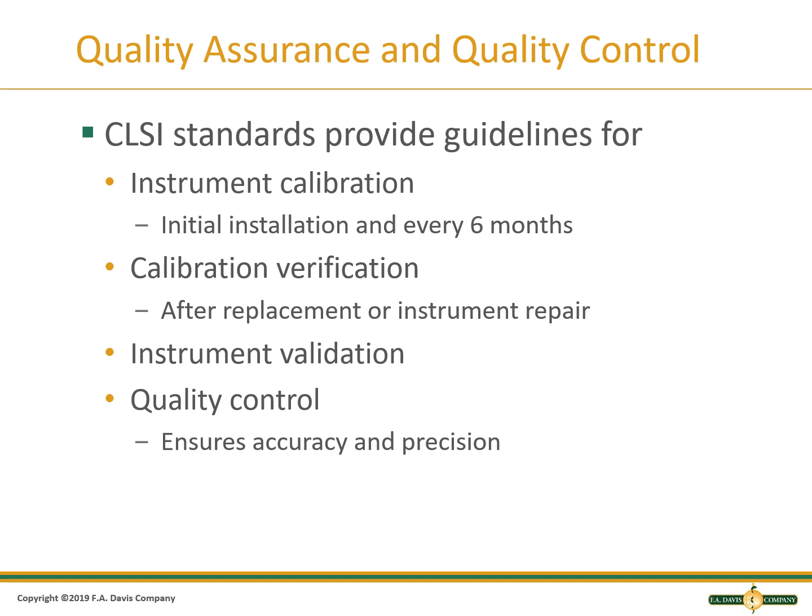You also have quality control, which ensures the accuracy and precision of your results to make sure you are providing the patient with accurate results, as far as the best quality care that you can provide.